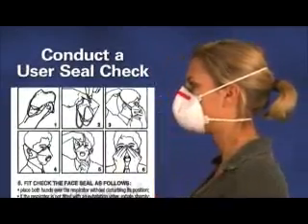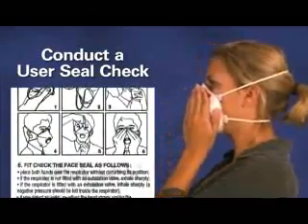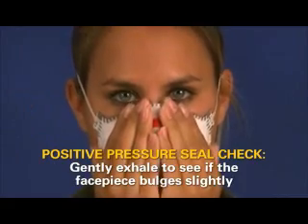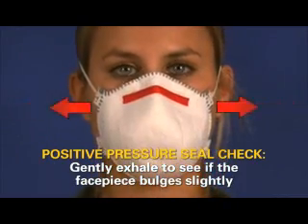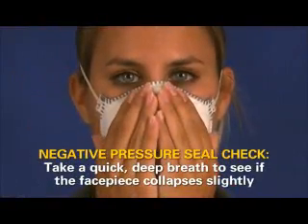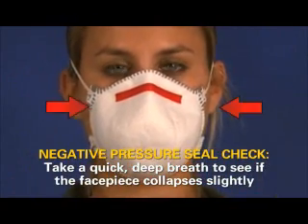It's essential to follow the manufacturer's user seal check instructions because the manufacturer knows the best method for checking their respirator. Generally speaking, the manufacturer's instructions are based on covering the surface of the respirator, usually with your hands, so that air is prevented from passing through the filtering facepiece. A positive pressure seal check is performed by gently exhaling to see if the facepiece bulges slightly. For a negative pressure seal check, take a quick deep breath to see if the facepiece collapses slightly.